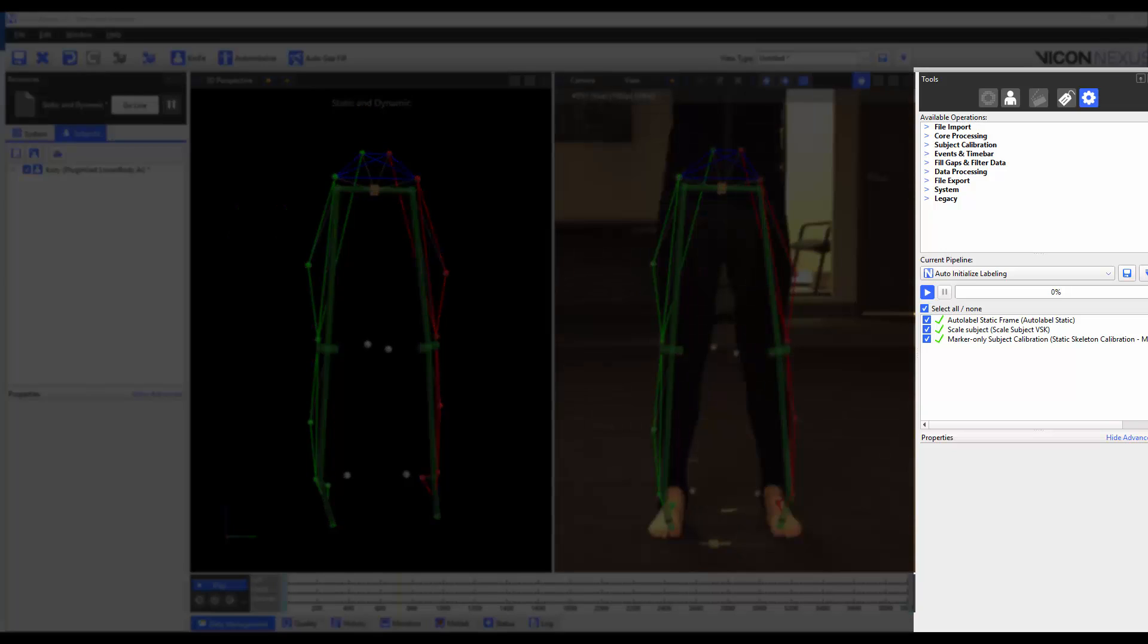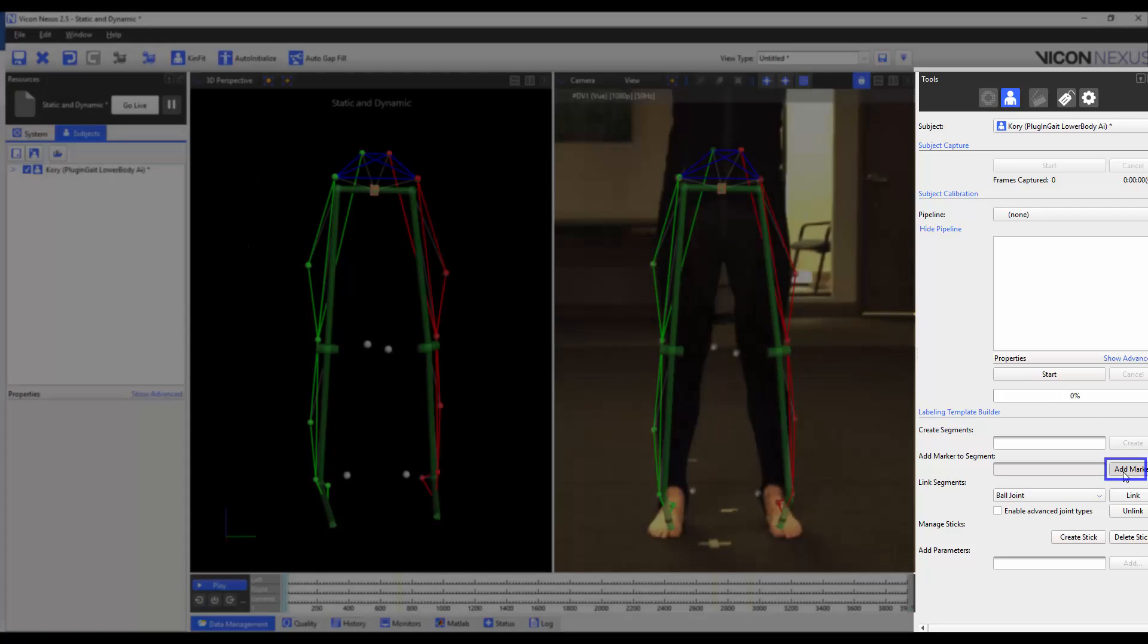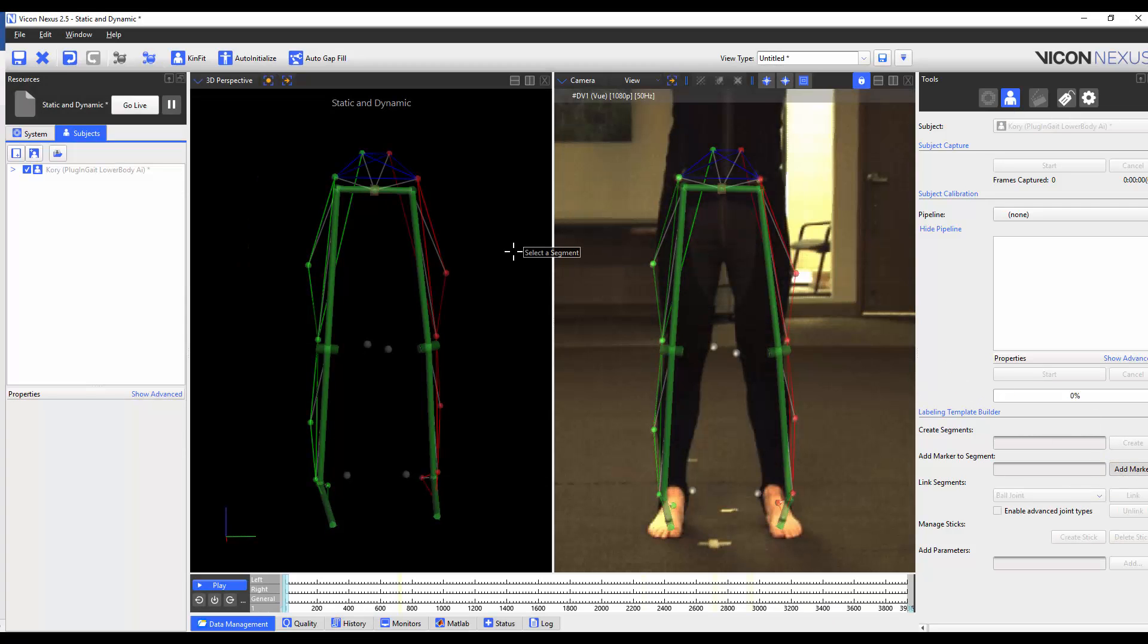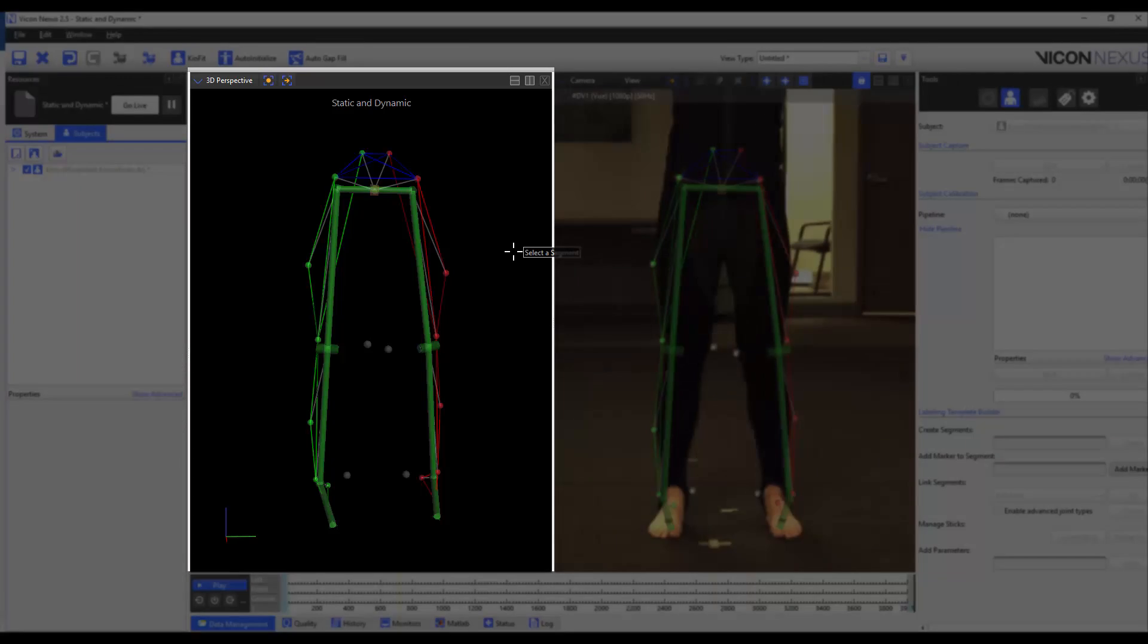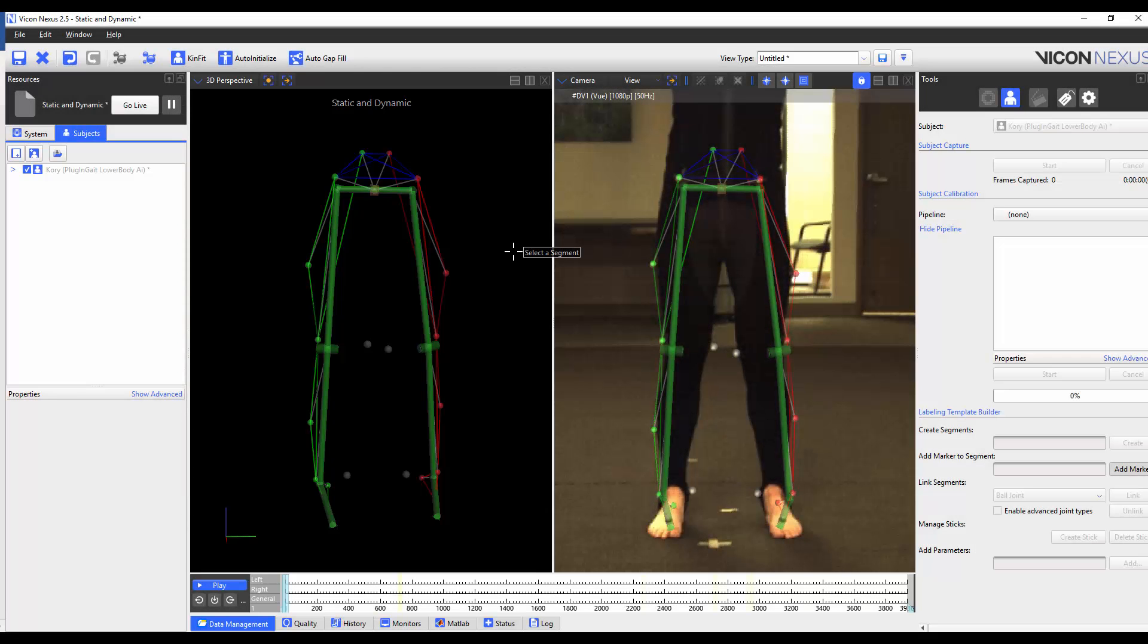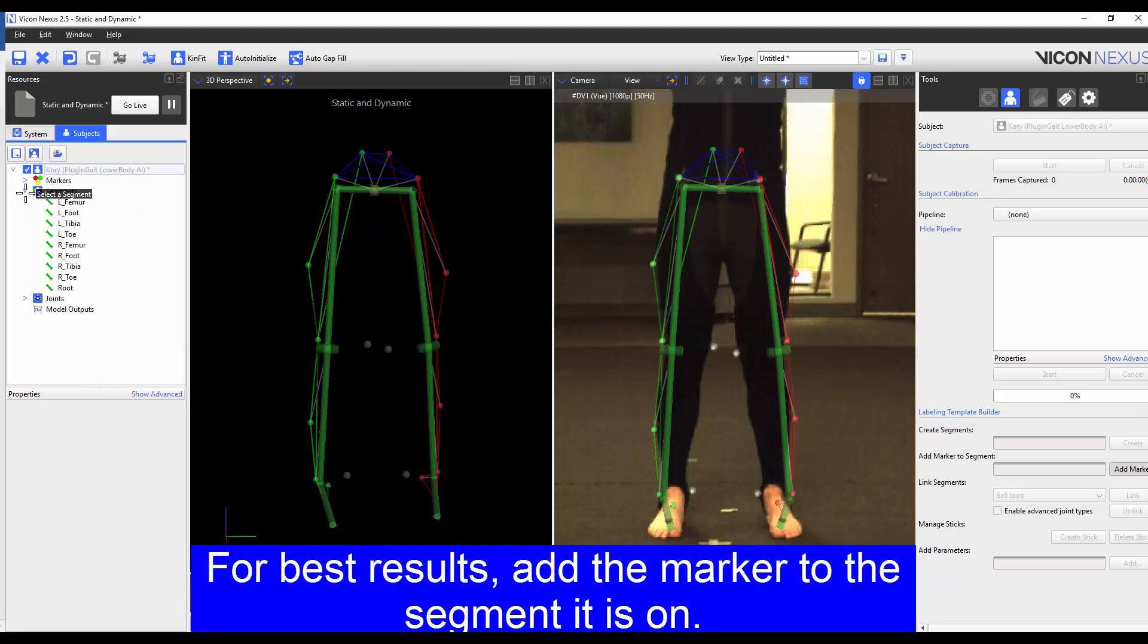To do so, I'm going to go to the Tools pane, Subject Prep tab and click on Add Marker. This then prompts us to choose the segment. We can either choose the segment from the 3D perspective or through the segments list in the Resources pane, Subjects tab. The first marker I'm going to add is the left medial knee marker. I'm going to place this in the left femur segment. And so, I select the left femur segment in the 3D perspective.